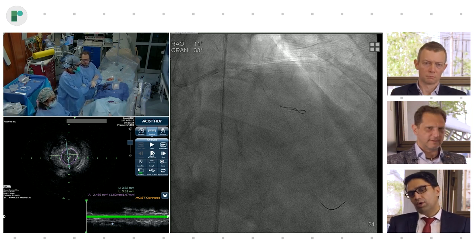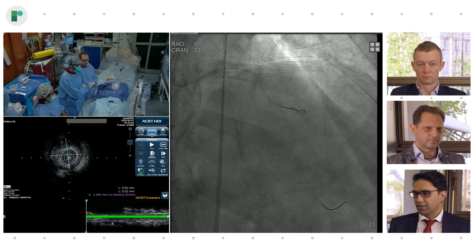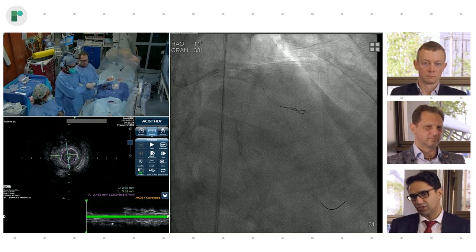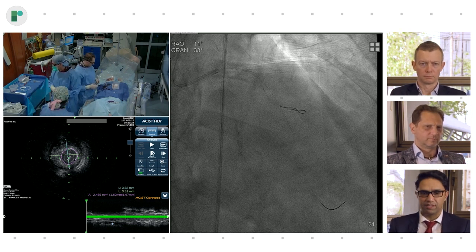One of the nice things about this strategy is that this now becomes more like a TAVR, so we're going to ask for all of our equipment up front. So we're going to take a 2.25/48, we'll have our proximal post-dilation balloon, we'll have our distal post-dilation balloon, so it's really a planned strategy, rather than sort of ad hoc asking for bits and pieces.